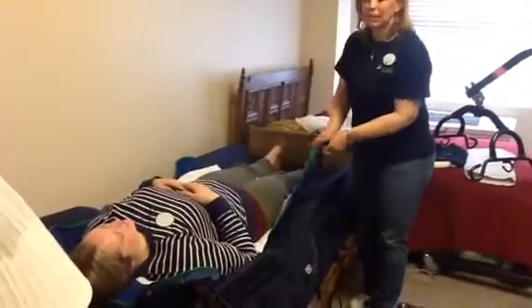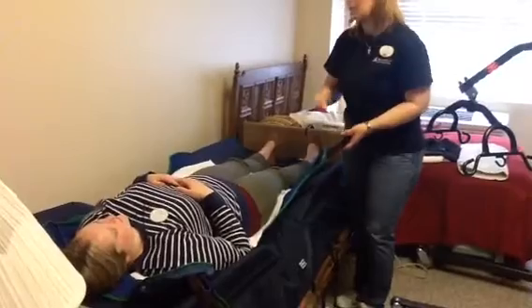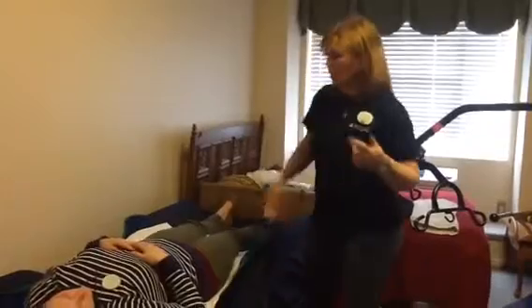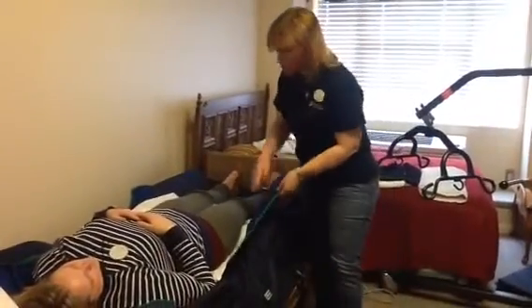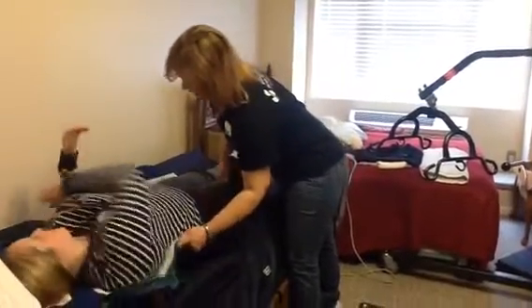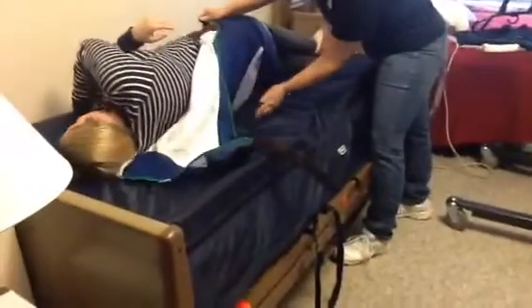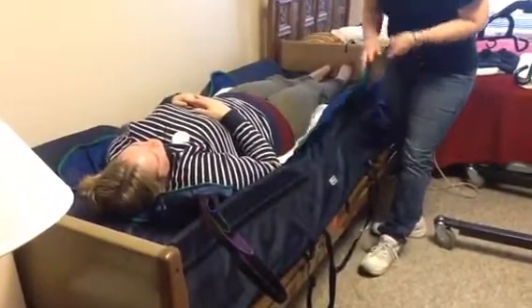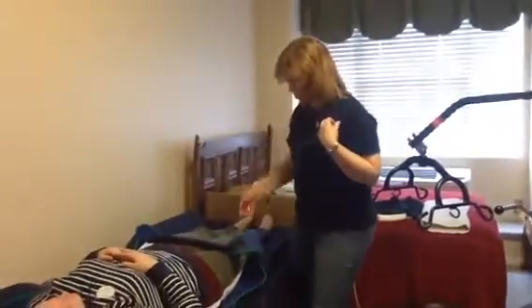So you have your sling, to put it under your resident. For easy purposes, we've already got our resident on her sling, but you do it by rolling him or her side to side till you get it underneath her. And there is a hole, so I'm going to ask my resident, we're going to roll you to your side, so you know where it goes. There's a hole at the bottom that goes obviously at the bottom for when they're sitting. And it's a little wider at the top, so it goes around their shoulders.